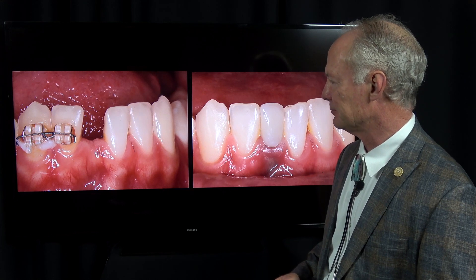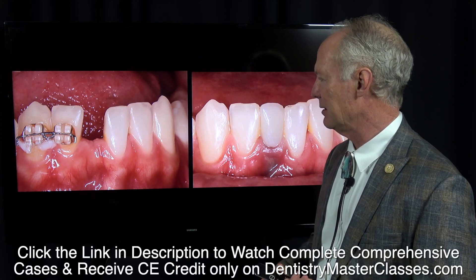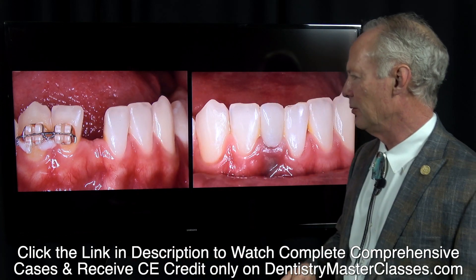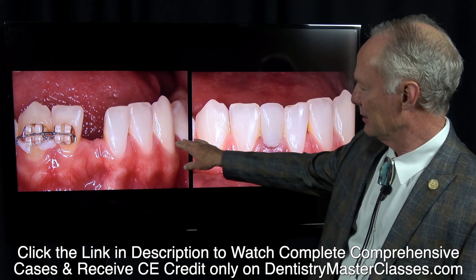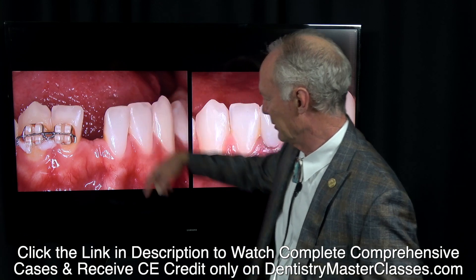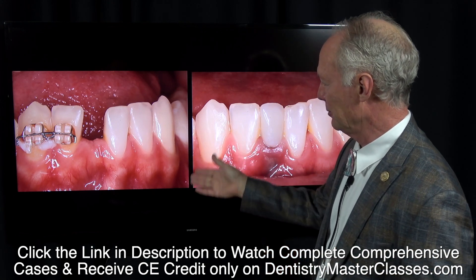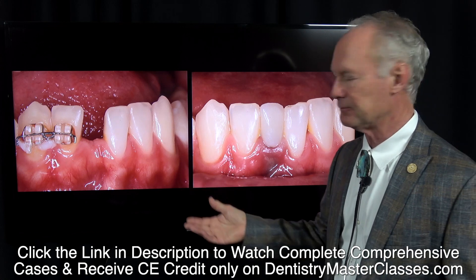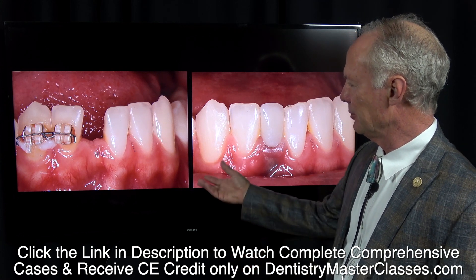You could do a Maryland bridge which fits on the back of the adjacent teeth — the lingual side is cemented to the lingual side of this tooth and this tooth. You really don't want to do a full crown retainer because the lower incisors are so small already. If you remove a millimeter and a half all the way around the tooth, you've just got a little toothpick remaining, and the chances of the tooth needing endodontics because of hypersensitivity are great, which exacerbates the chance that the tooth would fracture.